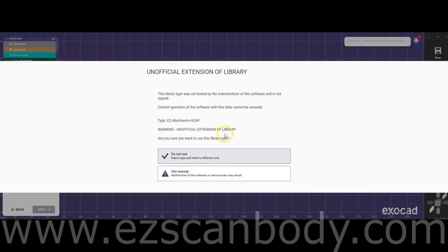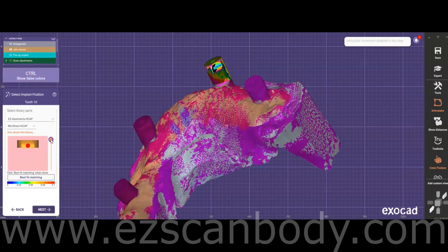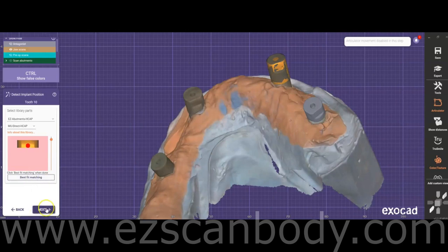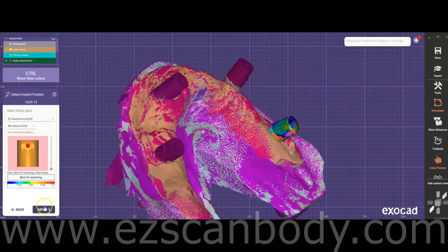To align, click on the same position of the red dot on the H-Cap scan body and adjust the level to match the height of the red dot. Hold the Control key while clicking the flat side of the H-Cap scan body on the model. If the color changes to purple or dark blue, the alignment is correct. If not, click a few more times to fine-tune the alignment.